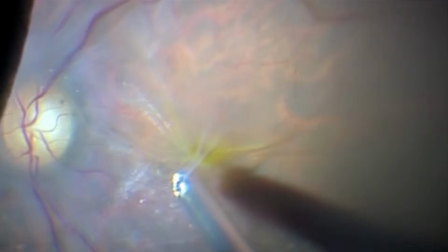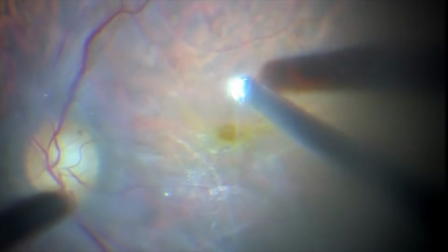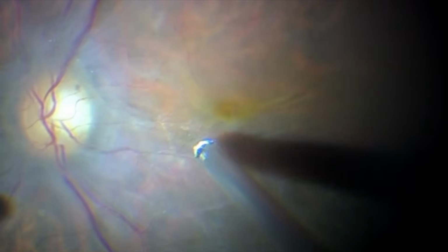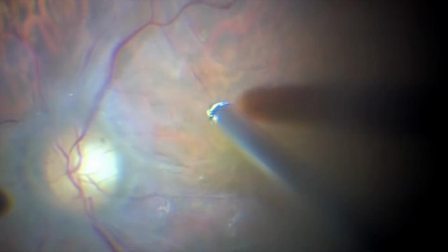When initiating the posterior vitreous detachment, it is possible to observe significant traction over the fovea, with risk of tissue damage. Therefore, the surgeon first isolates the central hyaloid and releases the vitreous 360 degrees around the fovea, without engaging vacuum and moving within the same plane.